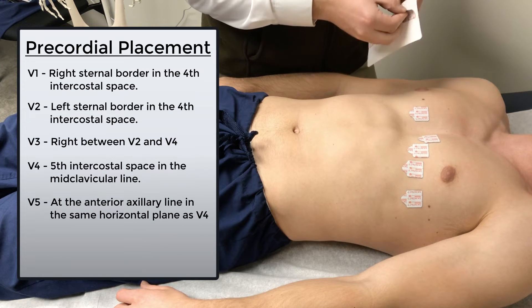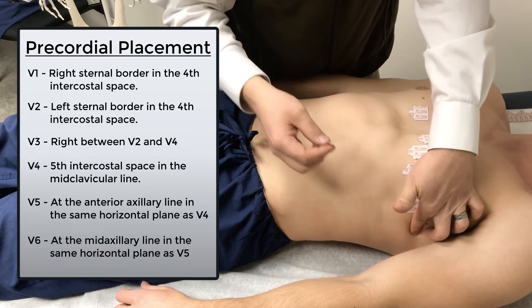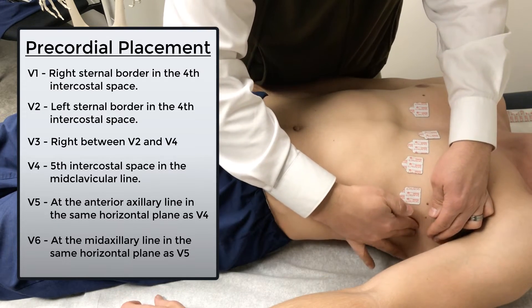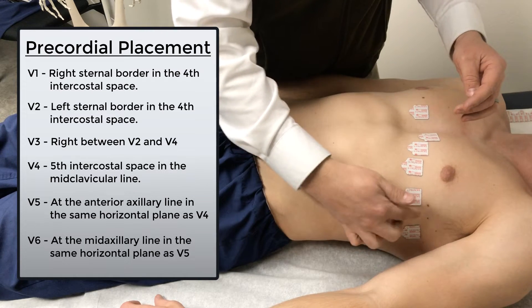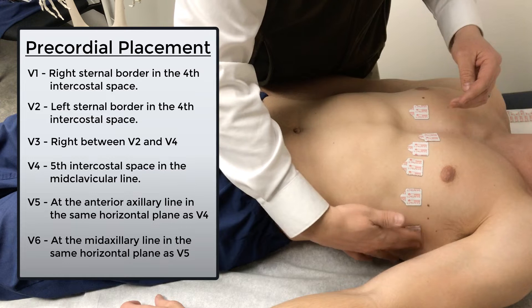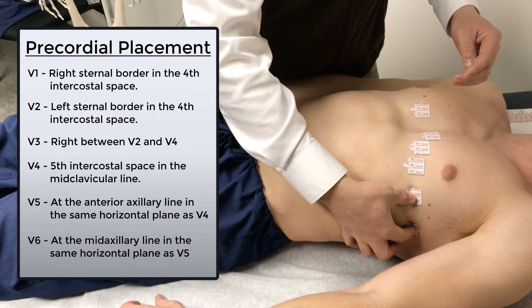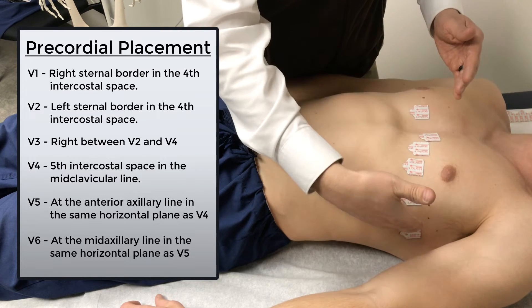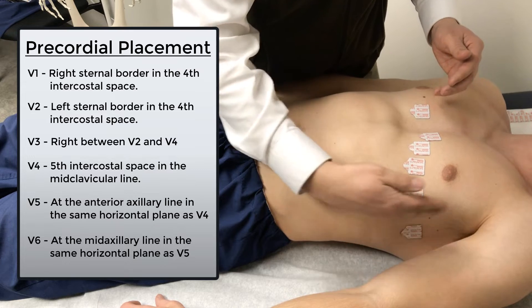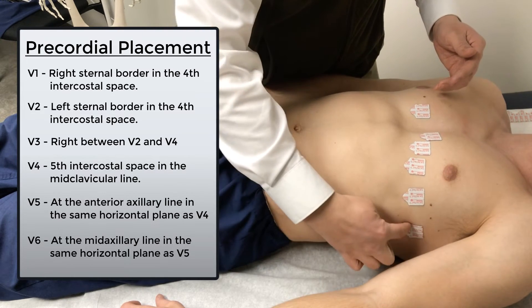V6 is in that same intercostal space, the same horizontal plane, but in the mid-axillary line. Oftentimes I see these placed too high — we really want that down here in the mid-axillary line, right underneath the patient's armpit. Because these two leads, when we're looking at our 12-lead, are going to give us that lateral view of the lateral wall of the heart. So make sure those are where they're supposed to be: anterior axillary line for V5, mid-axillary line for V6.